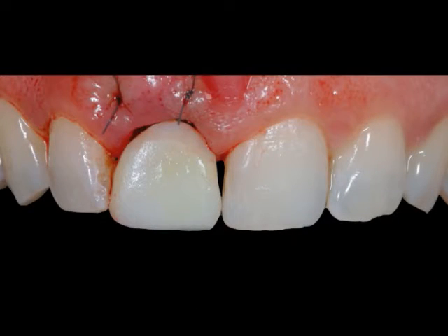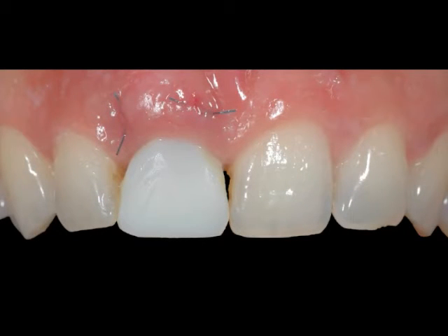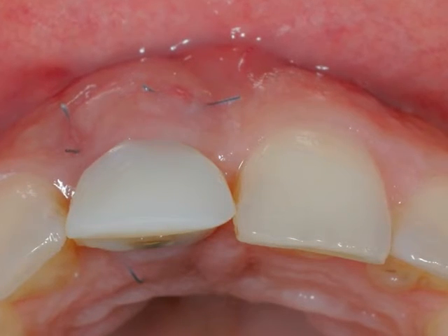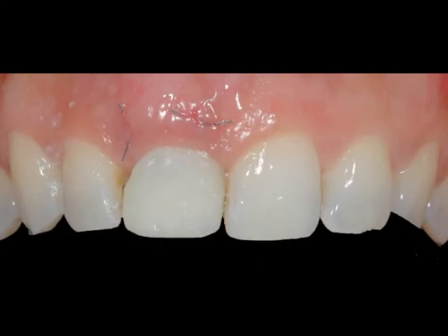We will then use resin in order to cement our provisional restoration, and we see in the first post-op clinical picture that we left a gap between the tissue and the provisional restoration. 1 week after surgery, we see that the tissue moved coronally, and we gained tissue not only vertically but also horizontally, which will give us the opportunity to play and push the soft tissue in order to sculpture it in the ideal position with our second provisional restoration after 3 months. Here we added some composite interproximally for aesthetic reasons.